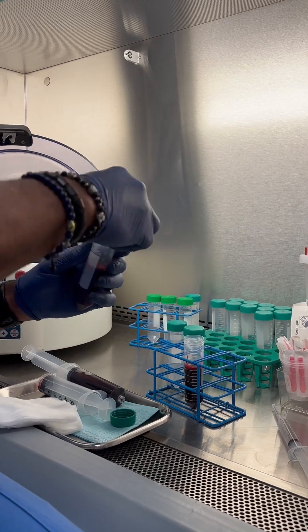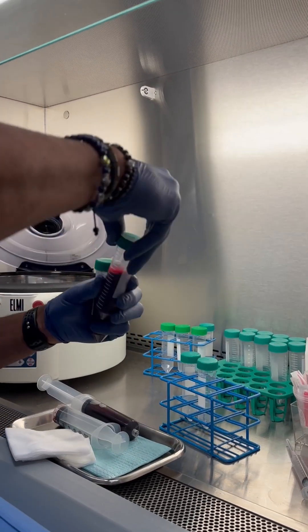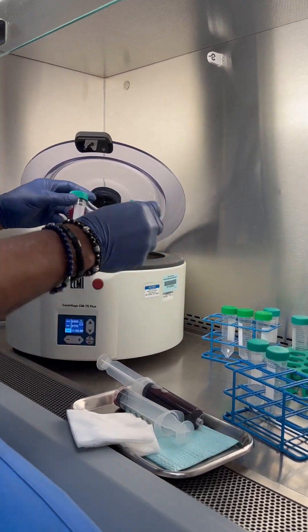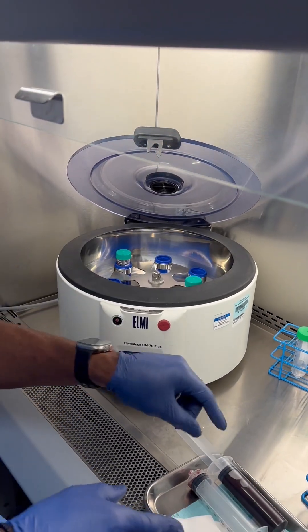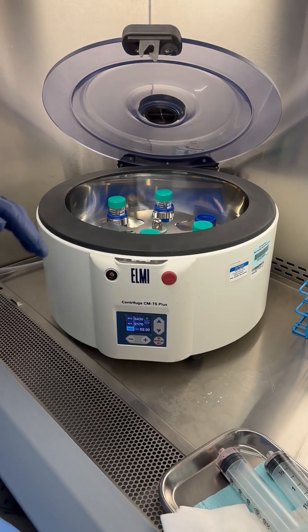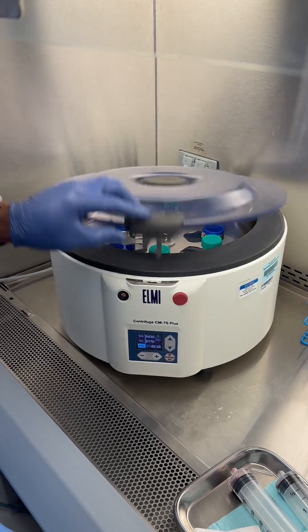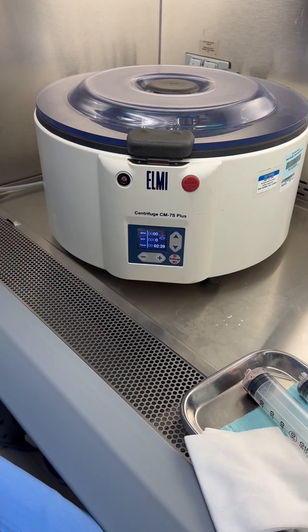A typical 60cc blood draw gets split into two 30cc tubes. Because we drew 120cc, we're going to do the same thing on the next set. So our setup for a 120cc draw is 30, 30, 30, 30 — four tubes. We'll close these up and this first spin is two and a half minutes.